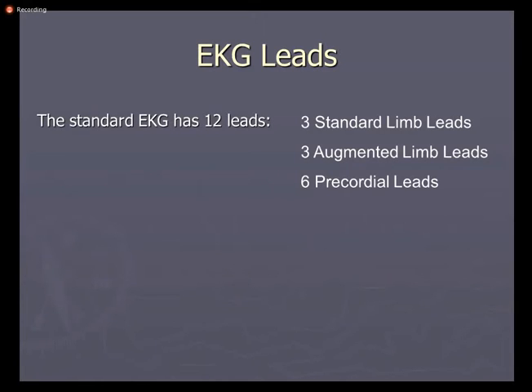And for our convenience, we have divided it to see the electrical activity anterior to the heart, lateral to the heart.